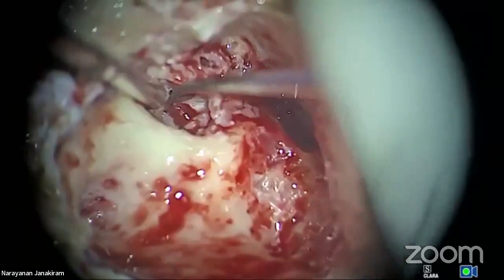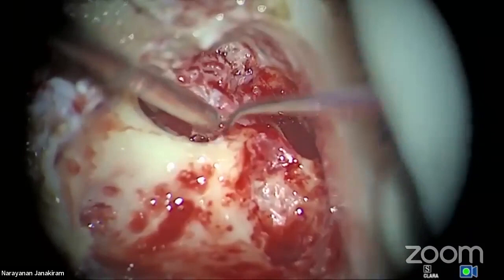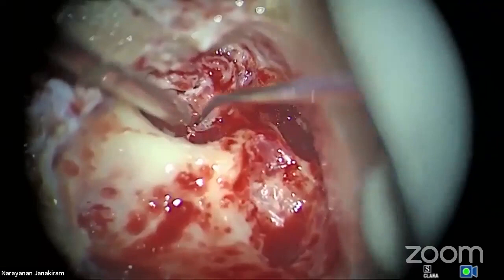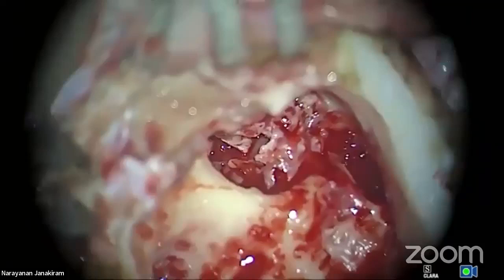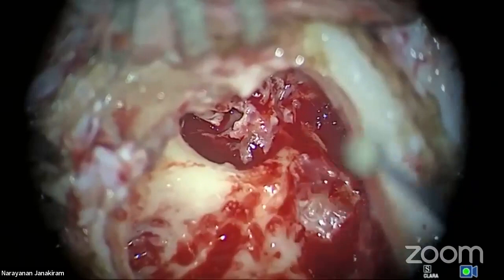So what should I do now? I have to expose the sinus tympani. You understand the point? See now. See, that's the facial nerve. Can you see here, all of you? See the facial nerve? Always, when you do sinus tympani drilling, tilt the patient towards you. This is very, very, very important, my dear friends. If you have a tilt away, then sometimes you can hit the facial nerve. That's a sinus tympani drilling.